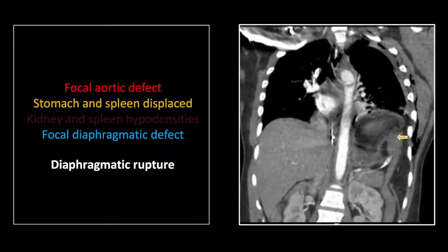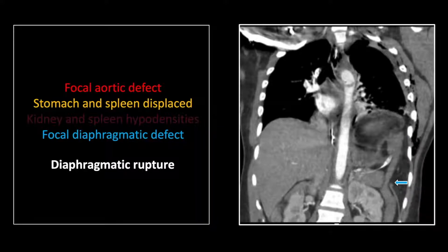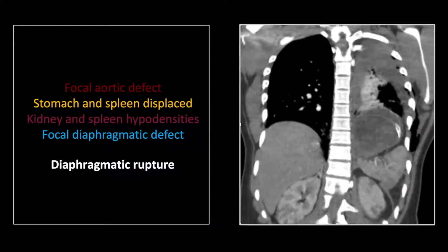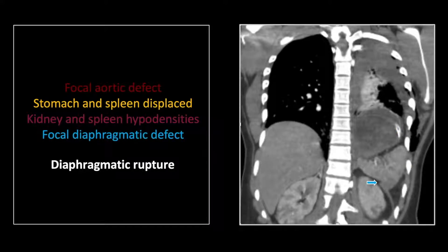Note the elevation of the stomach and colon, and you can see the free edge of the torn diaphragm. A cut further back also shows the elevated stomach and the elevated, rotated spleen. There again is the torn edge of the diaphragm above which the spleen is now resting.